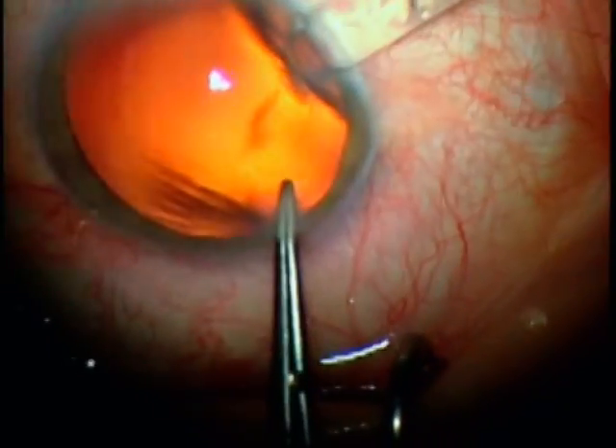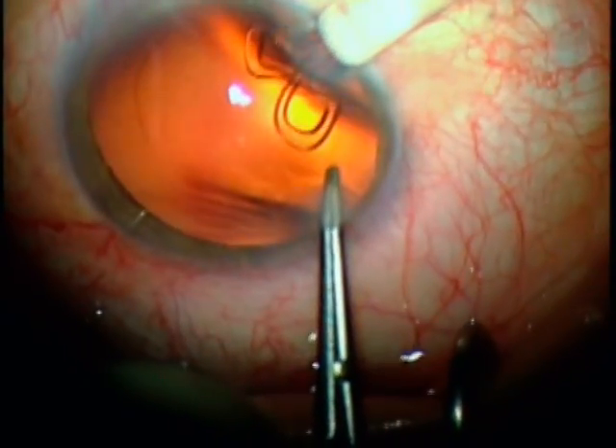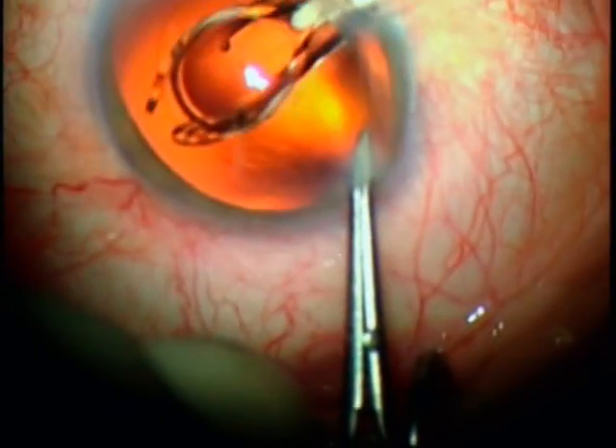The injector is placed into, but not through, the corneal incision, and the Acreos lens is injected into the anterior chamber. It unfolds slowly and controlled in a flower-like pattern.